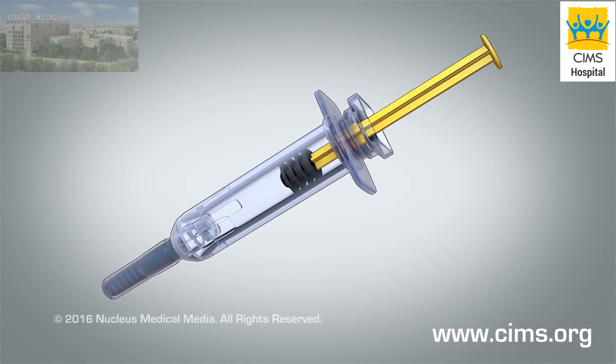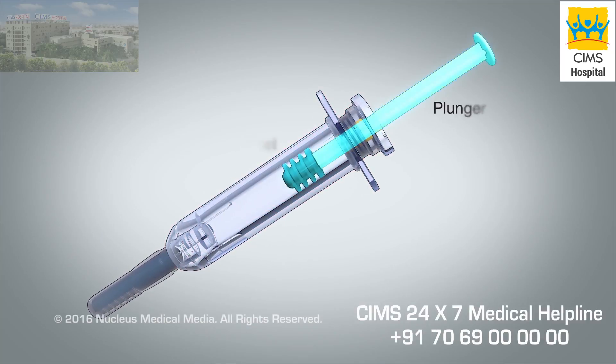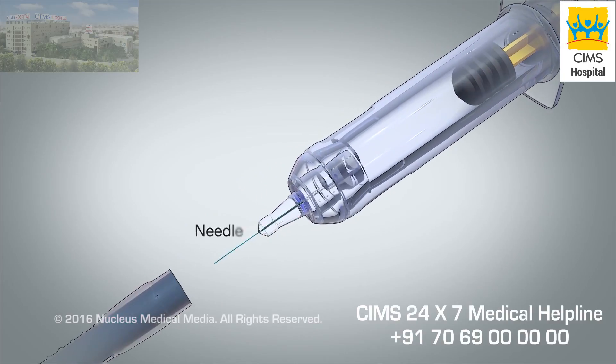The main parts of the syringe are the barrel containing the medicine, the plunger, the needle cap, and the needle.